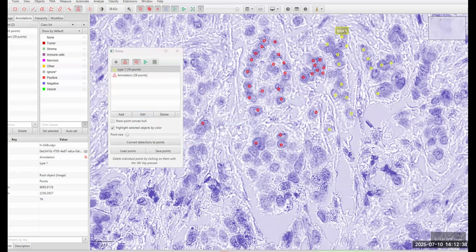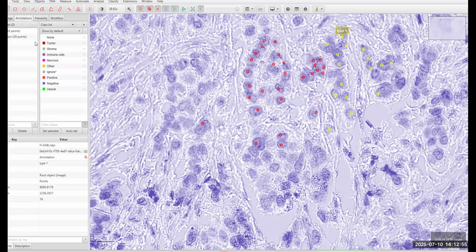Now, not just time, but fatigue. If you've ever done some long-term manual analysis, eventually you get tired and you get lazy. So things just tend to get a bit sloppy. So manual analysis is fine, but if it's taking a long time, then you should really look at computer-assisted analysis, which is what we're going to do.